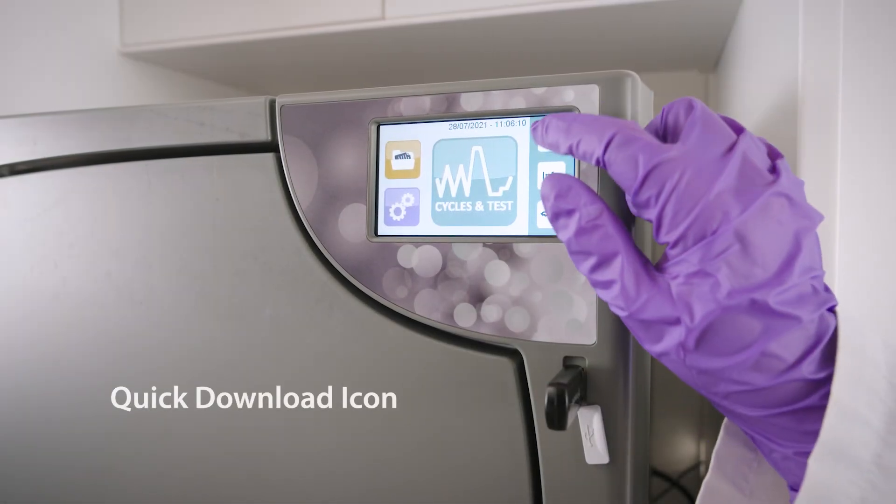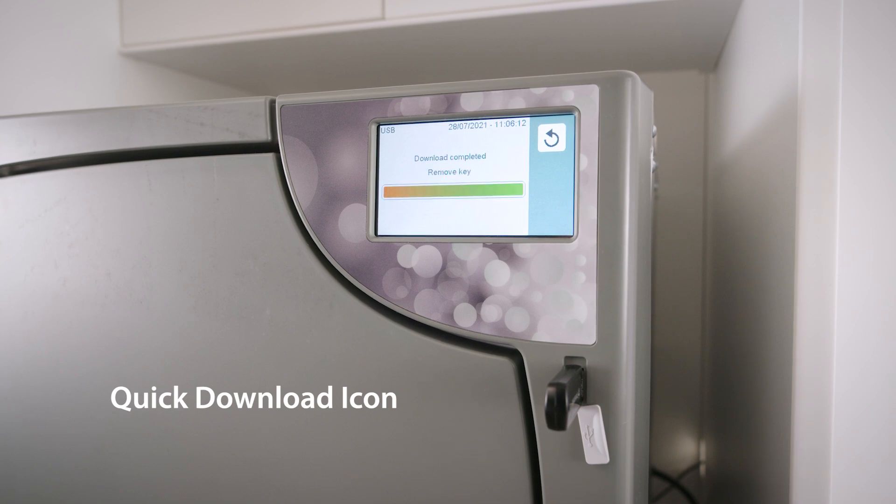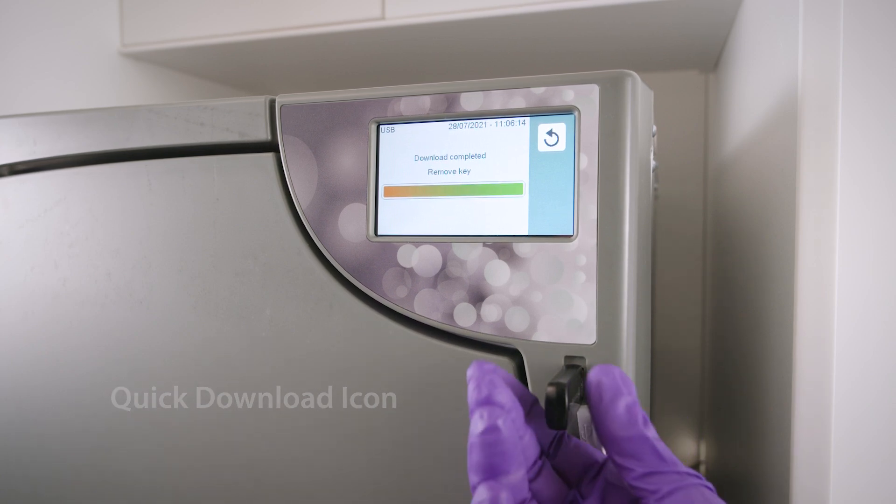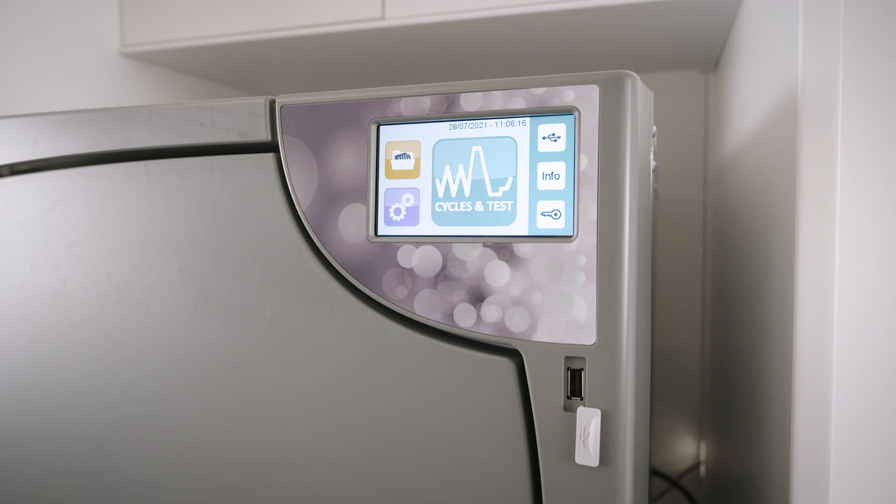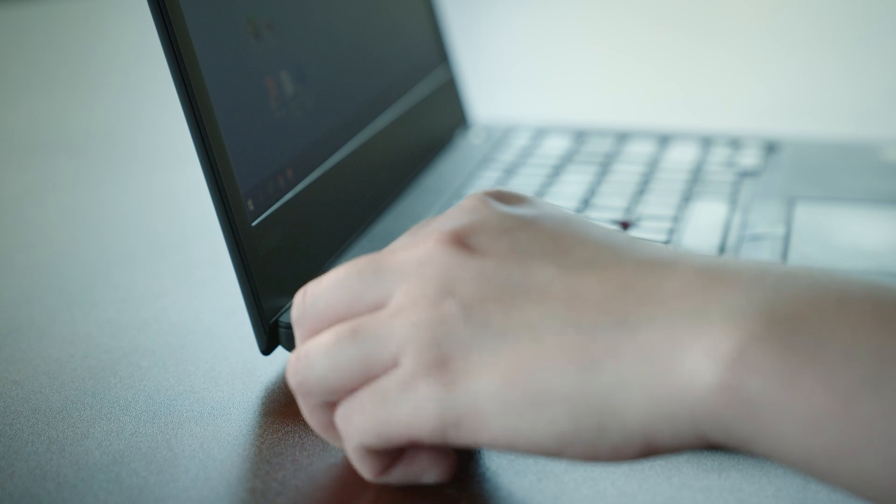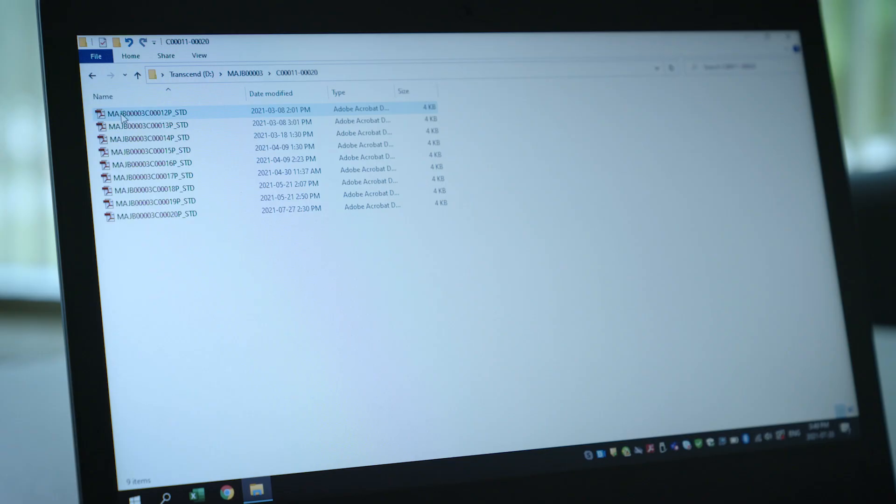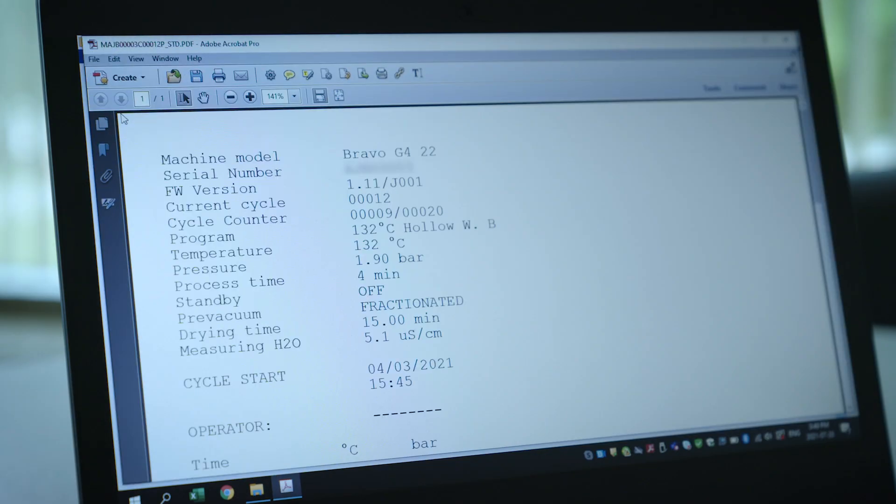The Quick Download icon is used to download the most recently unsaved cycles directly onto the USB key provided with the unit. This feature takes the guesswork out of data logging, ensuring that only the latest cycles that have not yet been transferred will be saved onto the USB key.